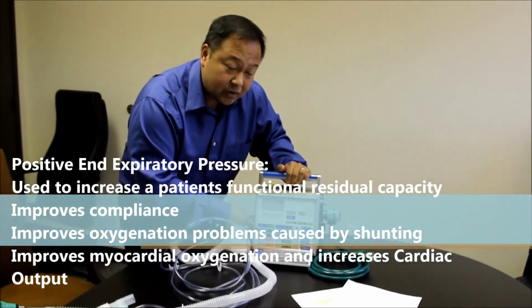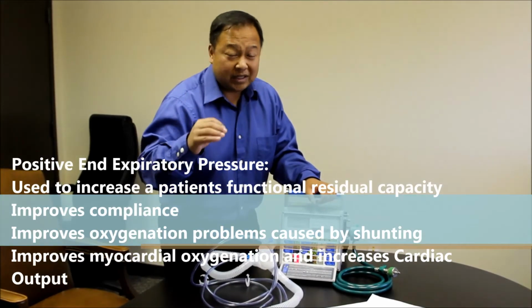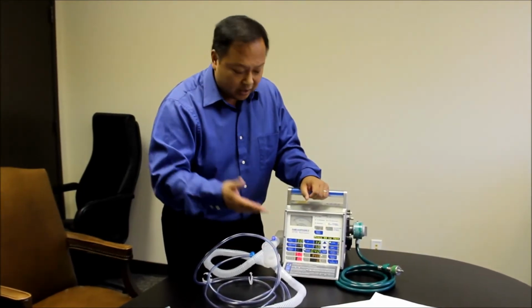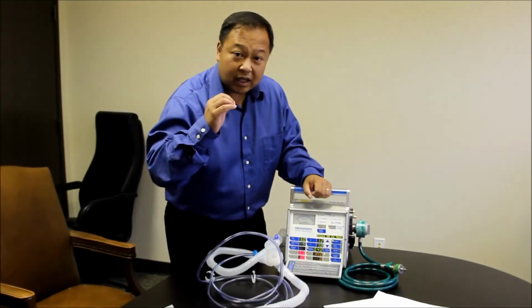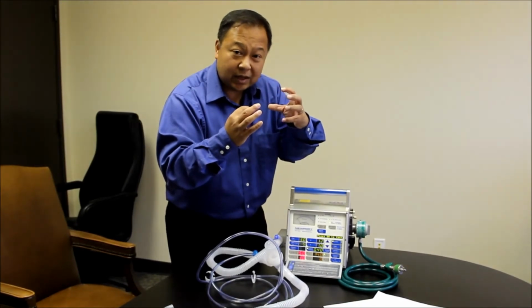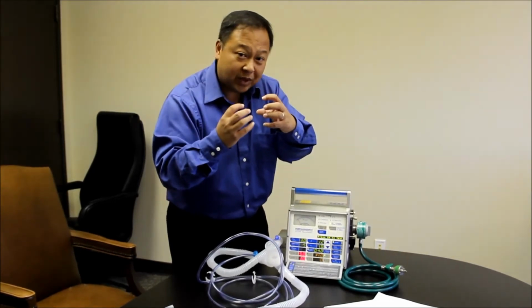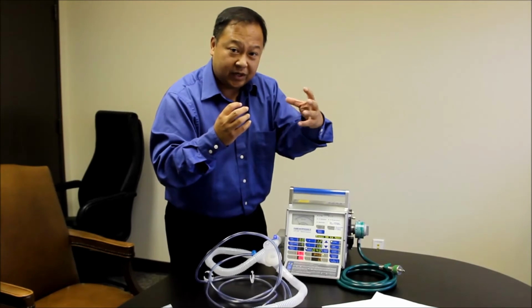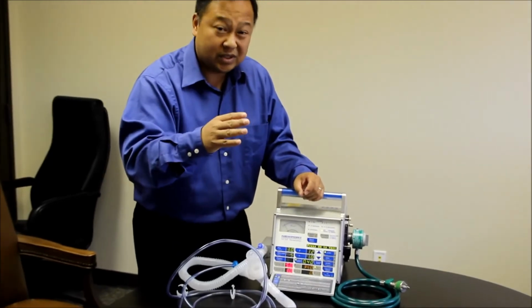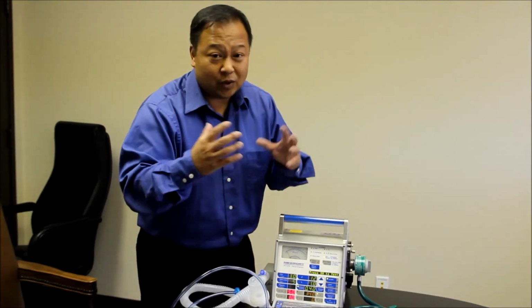I guess the analogy that I can use is, say for instance, a water balloon. Little water balloons, if you wanted to blow them up, they're extremely difficult to blow up because of the pressure that it exerts. So what PEEP does, once the balloon is open, it allows the residual pressure so that each time the patient breathes, they don't have to go back from the beginning and breathe out again. So it provides that end expiratory pressure so that the next breaths will be a lot easier for the patient. So it's just like a balloon. The initial pressure that you need to use to open up the balloon is difficult, but once the balloon is open, it's a lot easier to keep it open once it's already inflated. So that's the whole concept behind the PEEP.